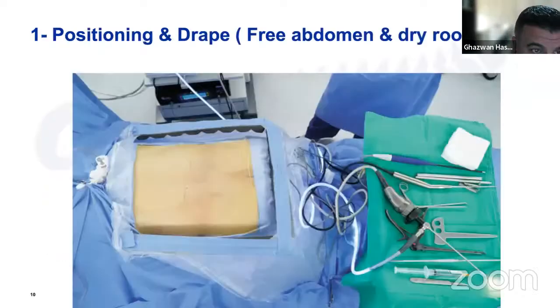And this is for the right side, and I put 10 steps to do it, and we will review it in detail. First of all, draping is very important in order to keep the theater and the OR dry. I'm using the one for gynecology, with a pouch that collects the fluid, and we suction it whenever we need.